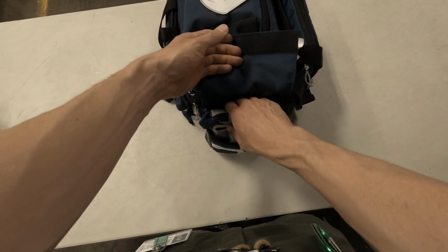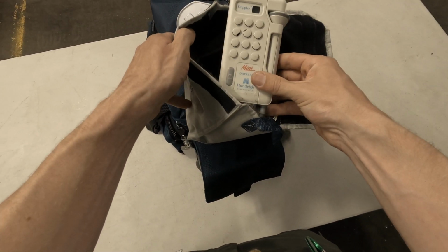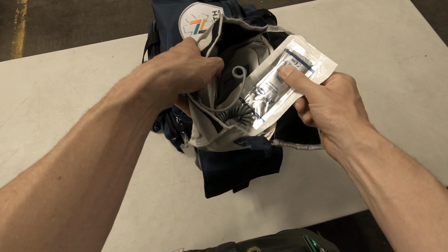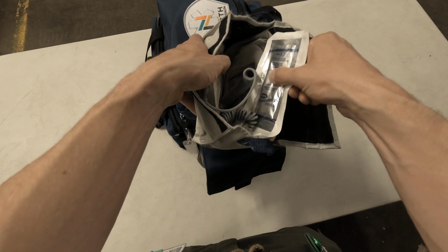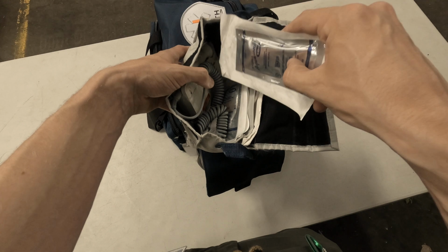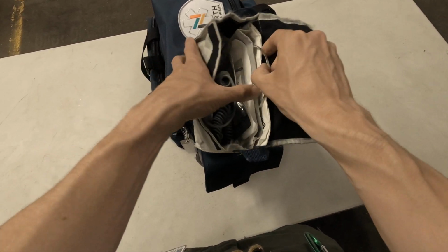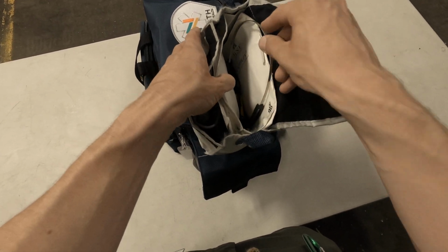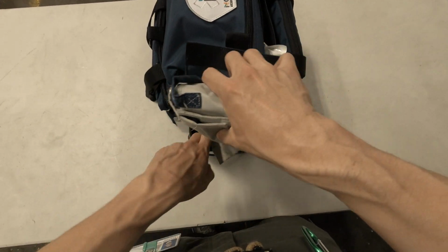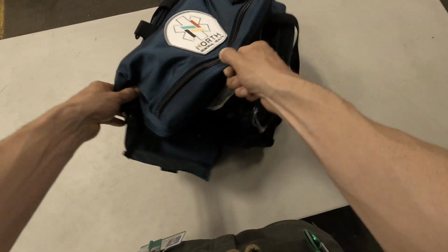So if you come into the other side pocket, this is the Doppler. All of these should have a Doppler, plenty of these little pockets of the lubricant gel for the Doppler, and then some headphones, just so you can wear those while you're trying to find a heartbeat, so the mom doesn't get a lot of anxiety just waiting for the heartbeat to come over the speaker there.